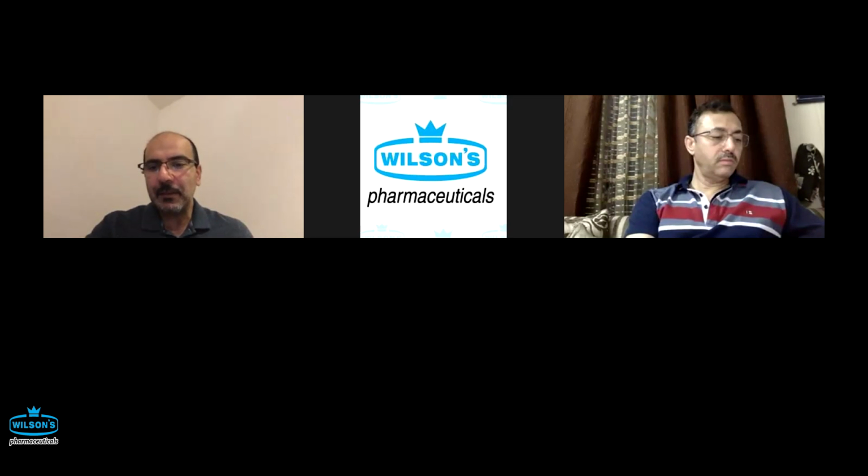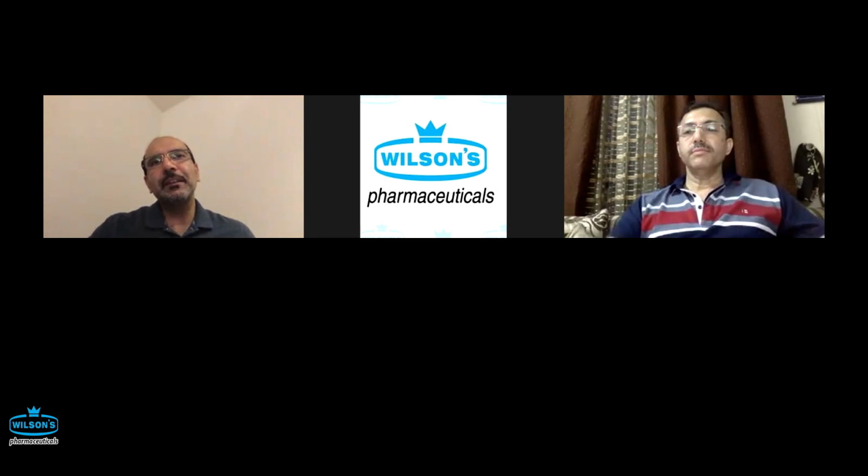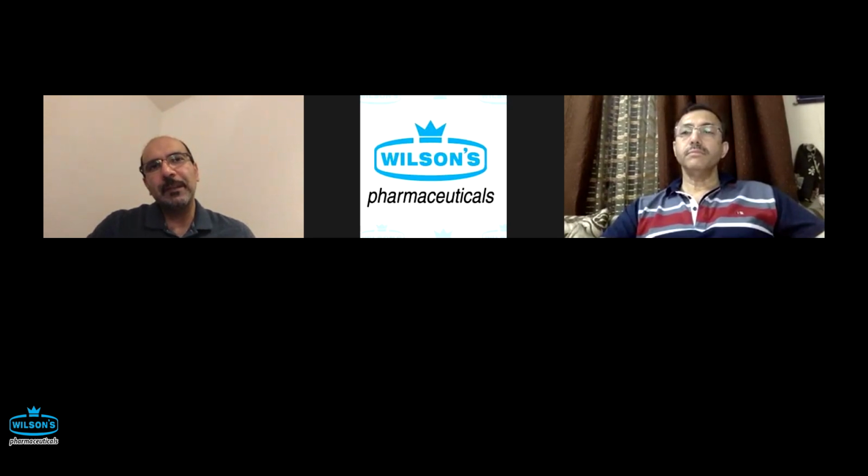And the second one was intubating the pylorus and D1 with the echo endoscope. I don't make a big deal of it personally. I essentially look for it, and similar to the ERCP scope, I lift the big wheel up a bit and then advance. So similar to the sunsetting position.